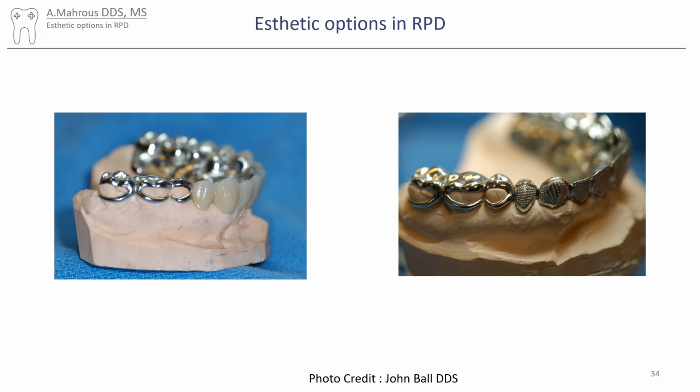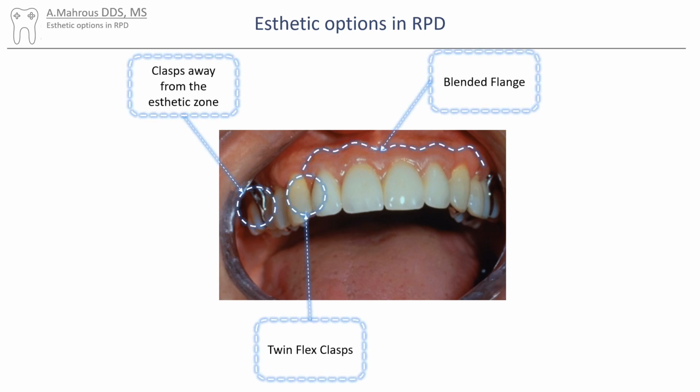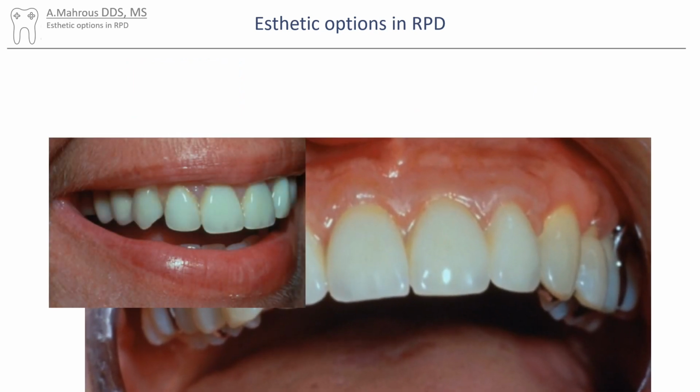This allows for composite resin to be added onto the framework, which has these metal beads for retention. When both goals of aesthetic RPDs are achieved, including hiding the clasp and blending the flange, the aesthetic results of RPDs can almost rival fixed restorations, as seen in the picture here.